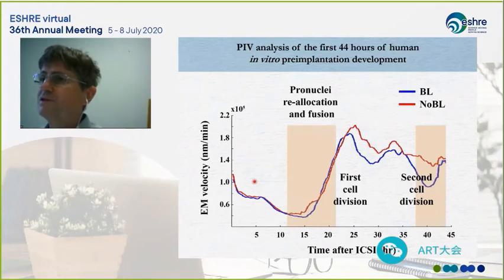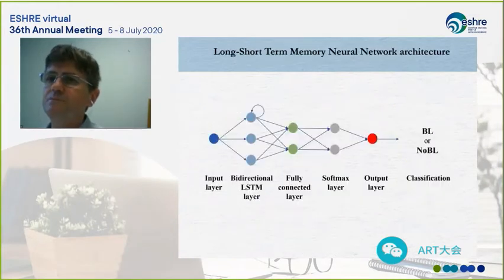Of course, this is when, again, as we did with the mouse, we group the two types of oocytes in one single comparative result. But we could not detect the difference between each single embryo. For this reason, we implemented this analysis with an artificial neural network.